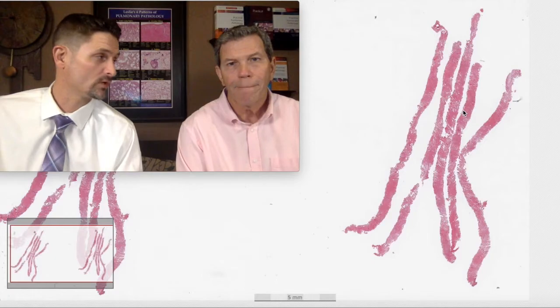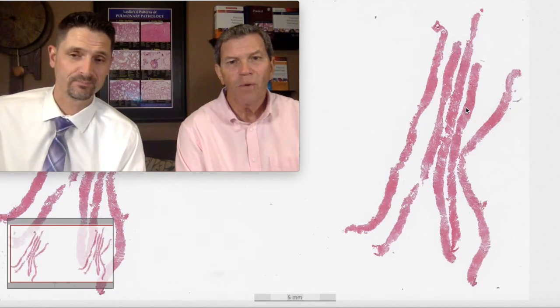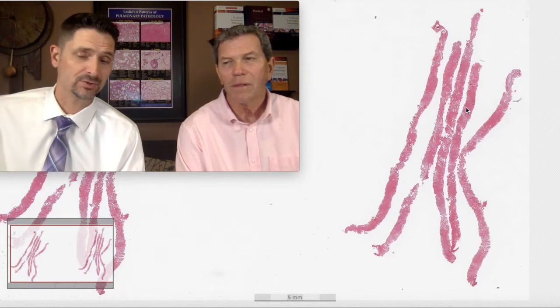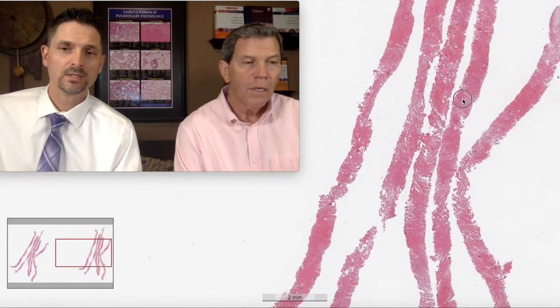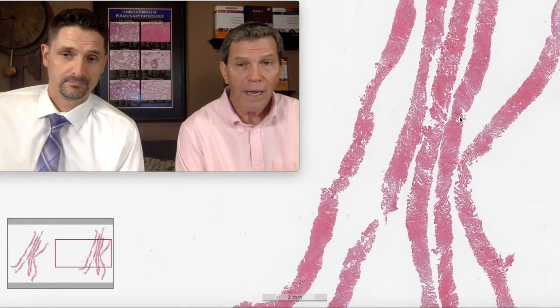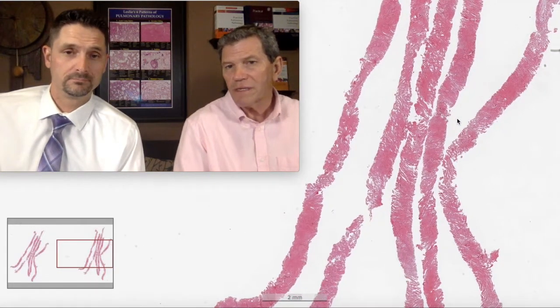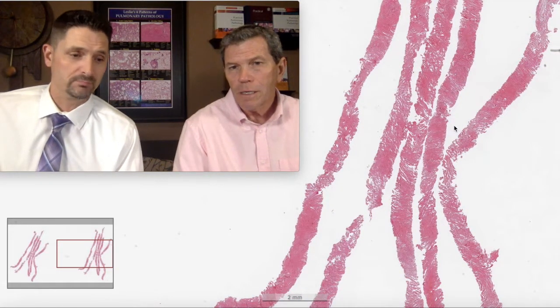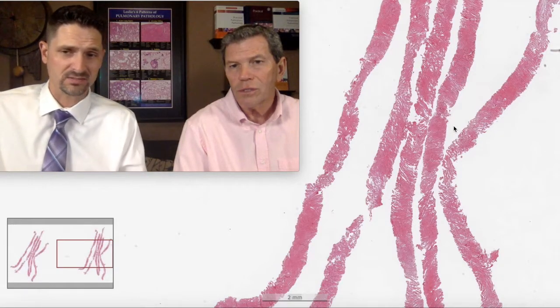Well, this was a 45-year-old female who had a right lung mass. Big one, I imagine. Actually, the imaging said 13.5 centimeter mass. Wow. So that's at least half the thorax, and probably looked even worse if it collapsed the lung. Right. Maybe a little bit of a mediastinal shift almost, because it's this big mass.